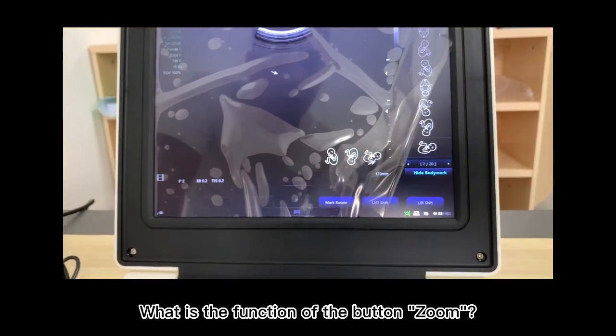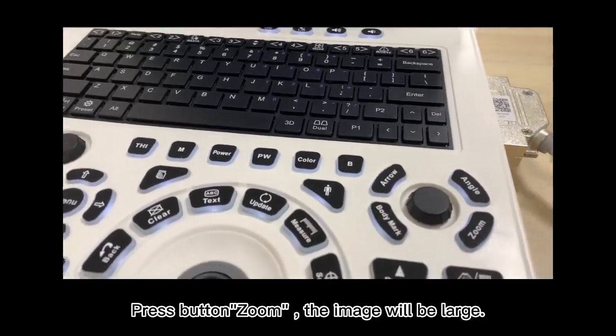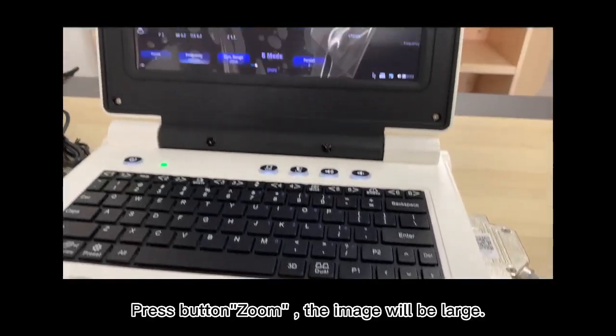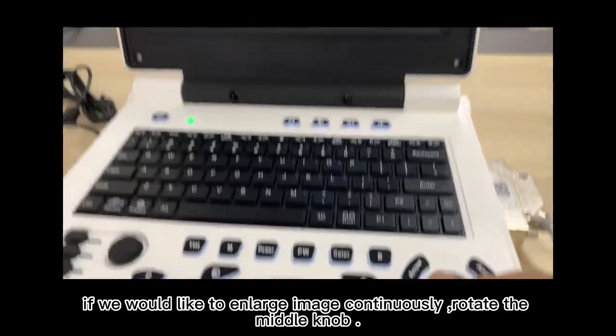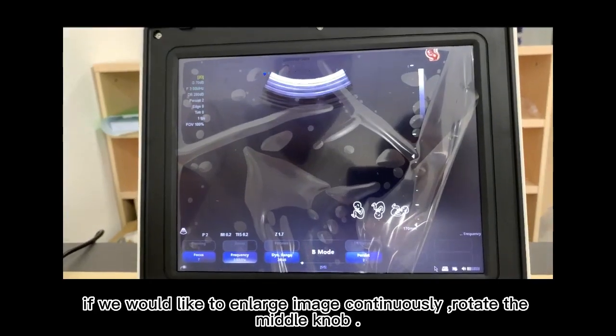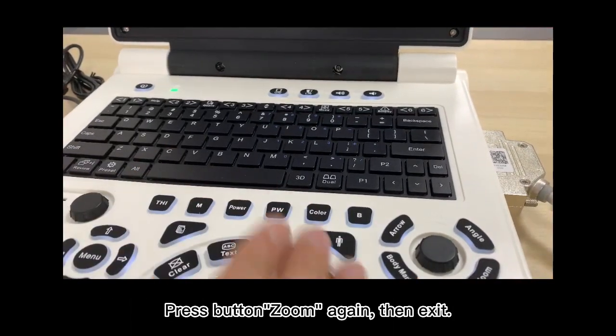What is the function of the button zoom? Press the button zoom, and the image will be enlarged. If we would like to enlarge the image continuously, rotate the middle knob. Press the button zoom again to exit.